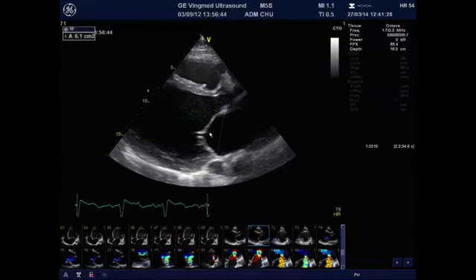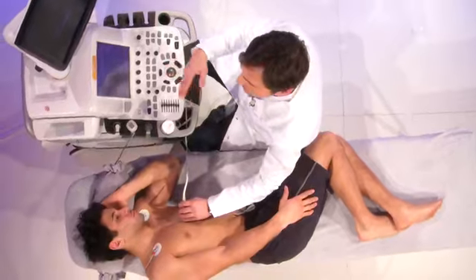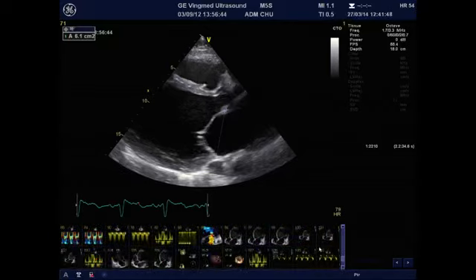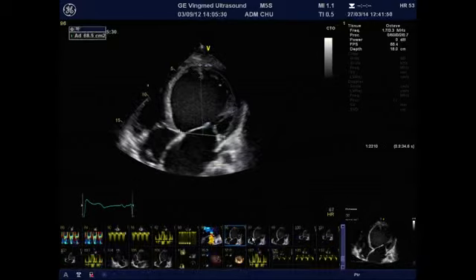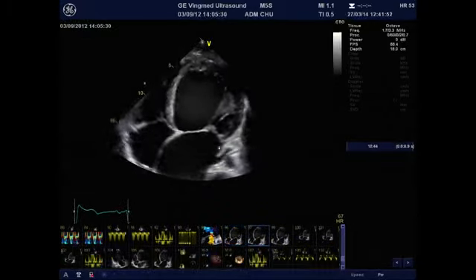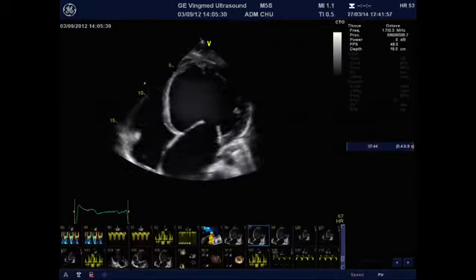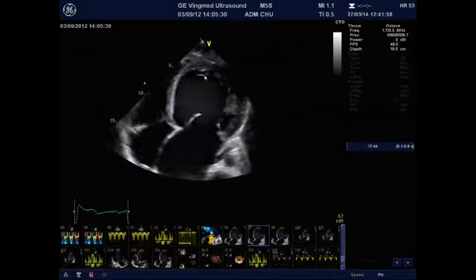If we want to continue the analysis of the deformation of the mitral valve, there are 3 parameters that should be taken into account. The first is the severity of the deformation, and here we have the systolic tenting area using the parasternal long axis view, but we can also use the apical view, where again you have the displacement of the coaptation points toward the apex.